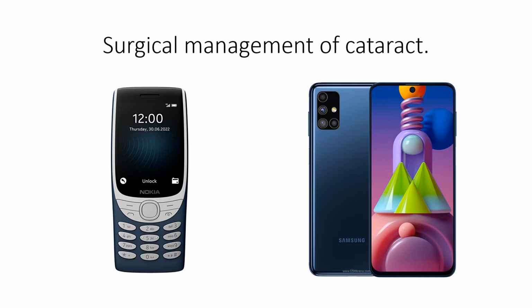Similarly, when we talk about management of cataract, we have surgical options, and one of them is phacoemulsification, which is like this smartphone, and it has features which make it more appealing to the parents, patients, and the surgeon as well.